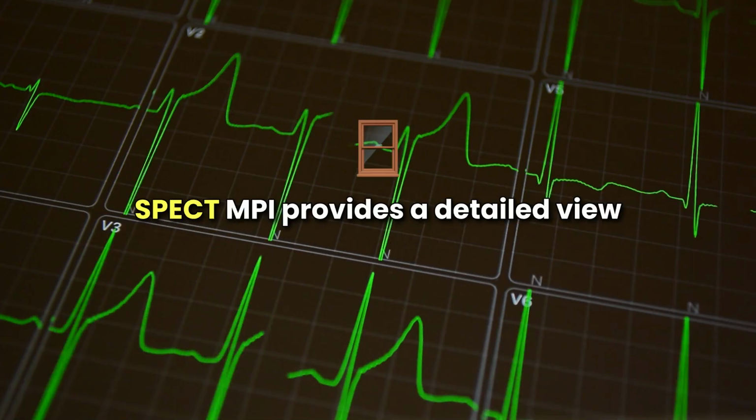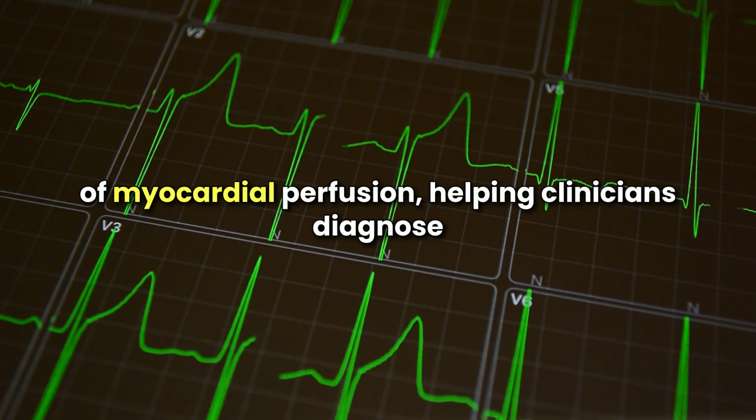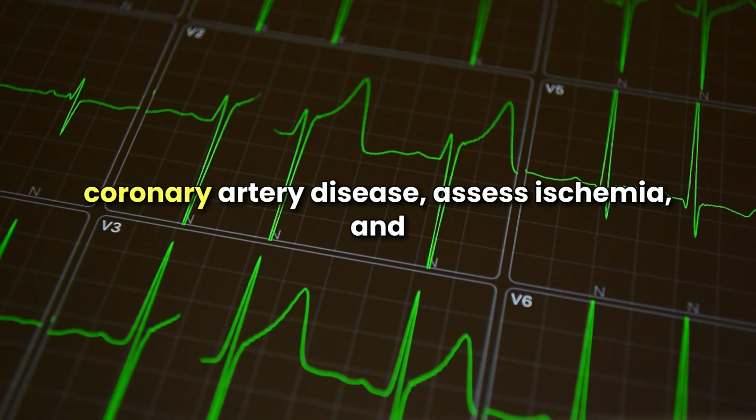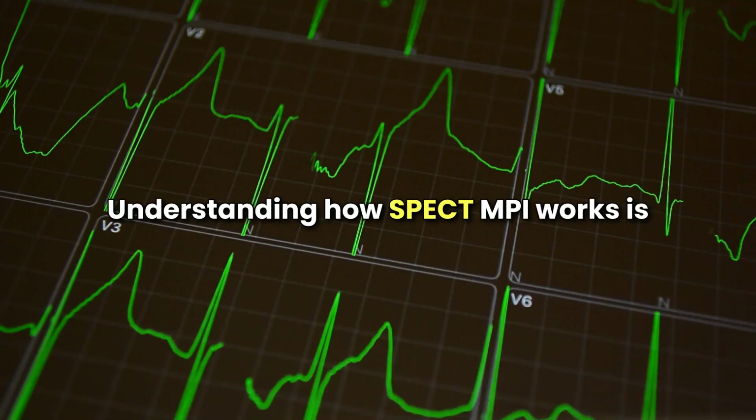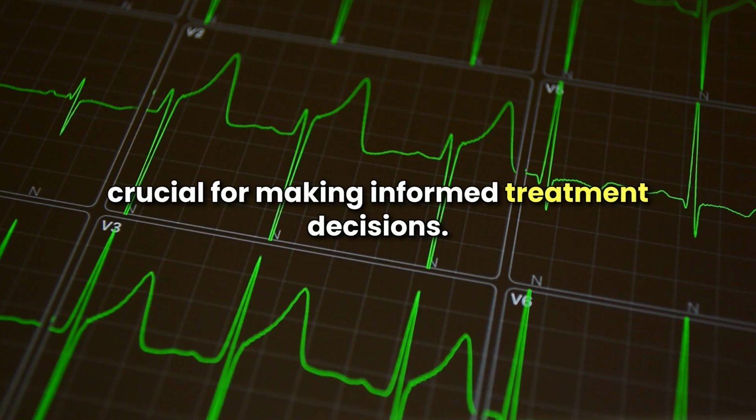SPECT MPI provides a detailed view of myocardial perfusion, helping clinicians diagnose coronary artery disease, assess ischemia, and evaluate heart muscle viability. Understanding how SPECT MPI works is crucial for making informed treatment decisions.